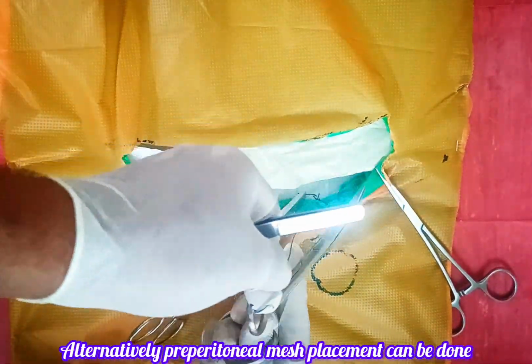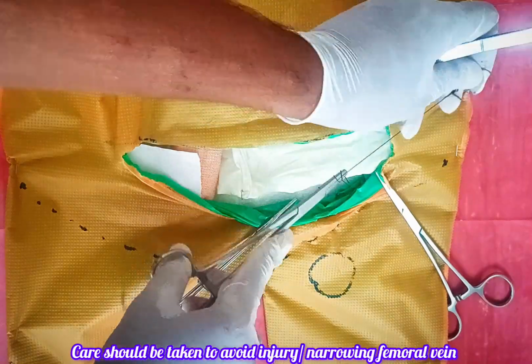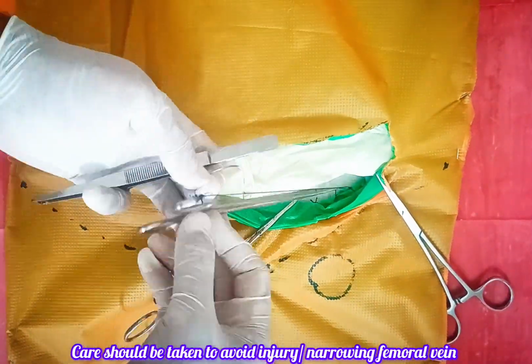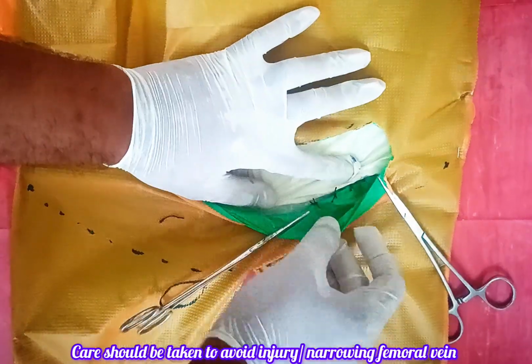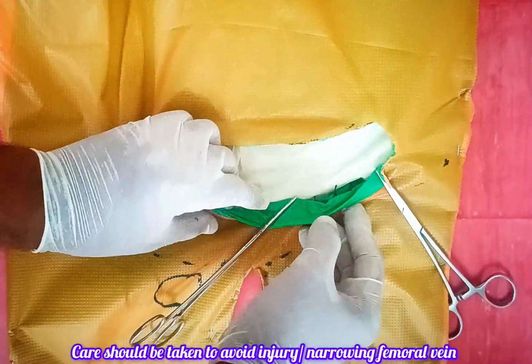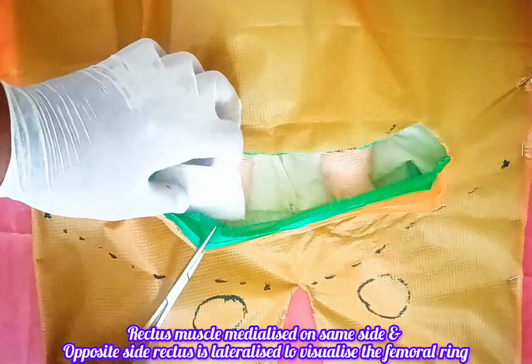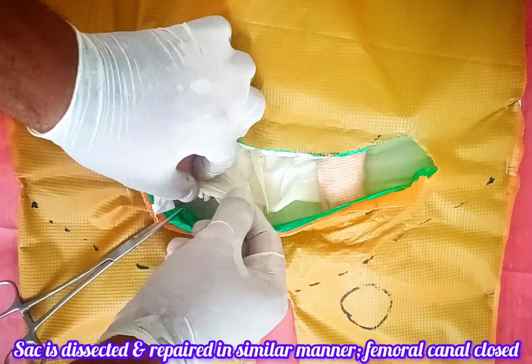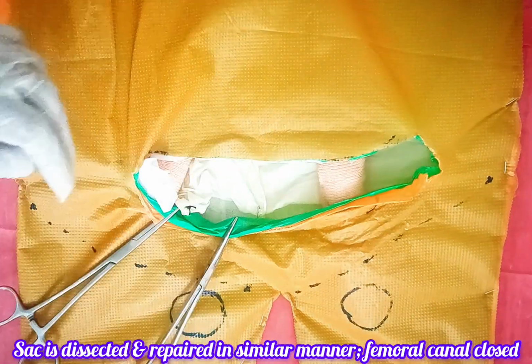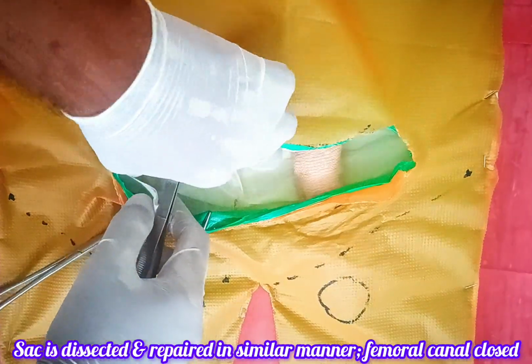Alternatively, preperitoneal mesh placement can be done. Care should be taken to avoid injury or narrowing the femoral vein. Now femoral canal is completely closed from above. Rectus muscle is medialized on same side and opposite side rectus is lateralized to visualize the femoral ring. Sac is dissected and repaired and femoral canal is closed in similar manner as opposite side.